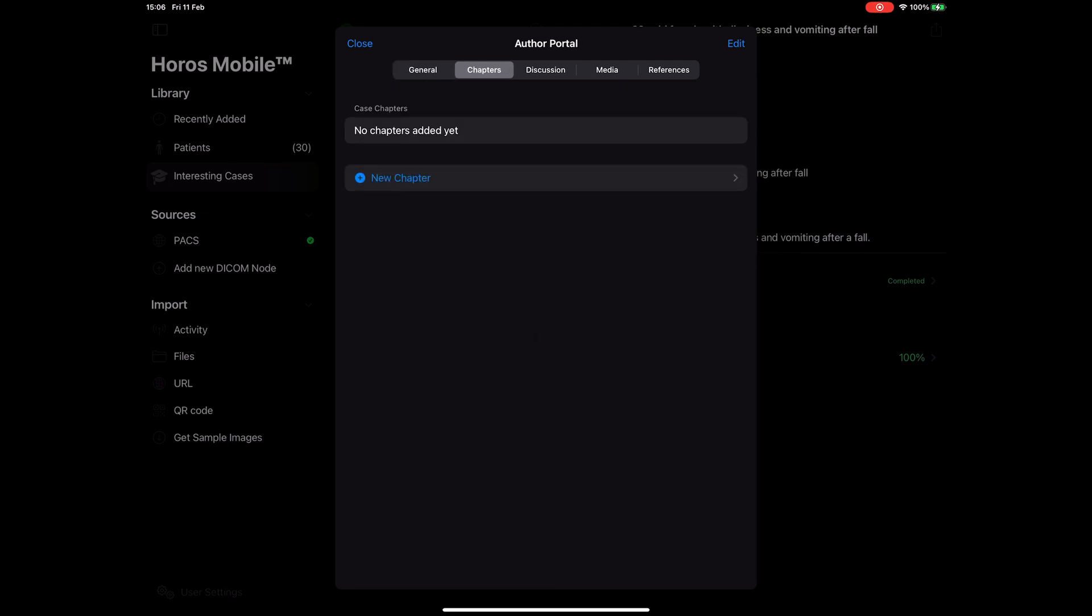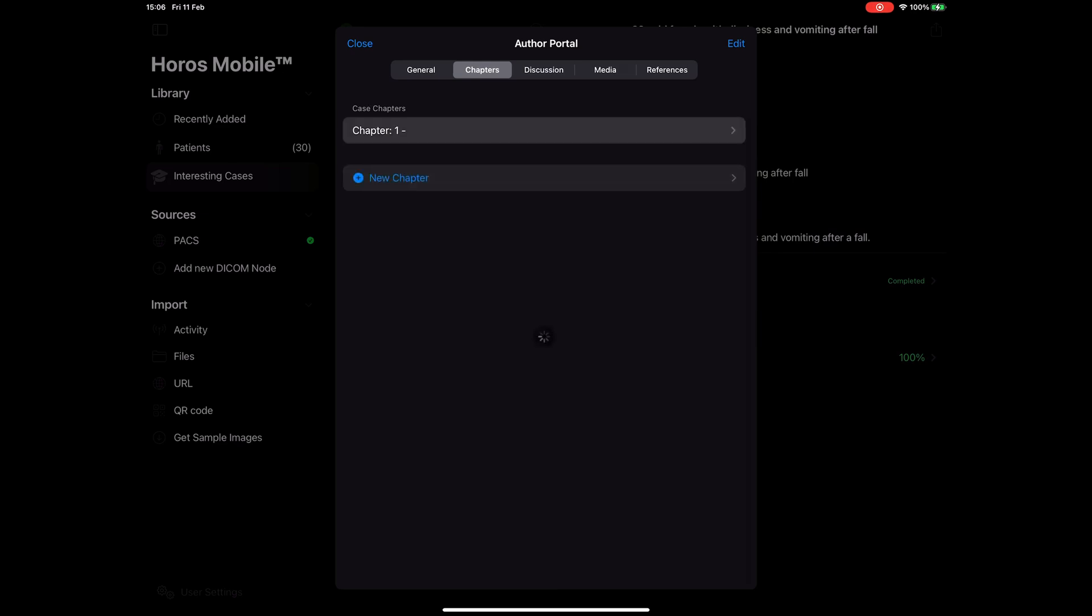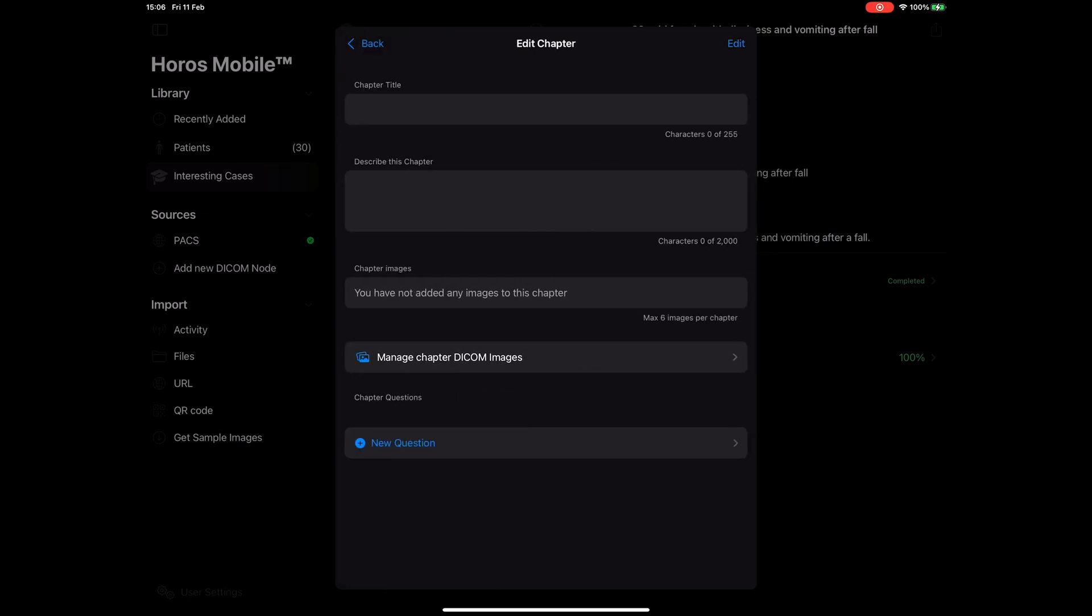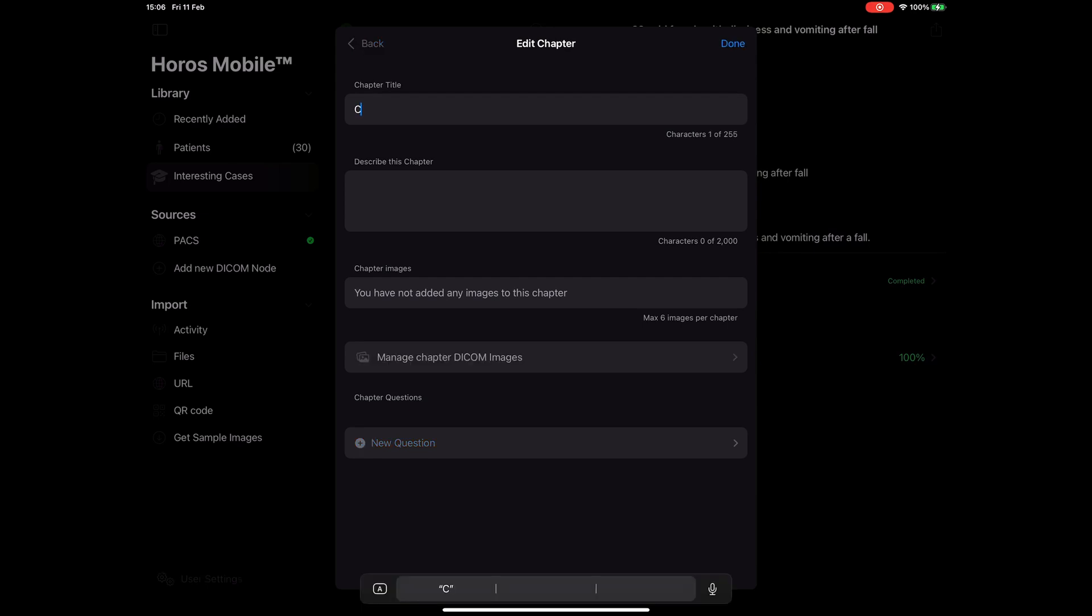Chapters is an easy way to separate your interesting cases into different sections and enter quiz questions for each one of them. You can add new chapters by tapping on the new chapter button. We can have as many chapters as we want, but we'll focus on just one right now. In this view you can give a title and description to your chapter. You can leave these blank if you don't want to fill in any information.